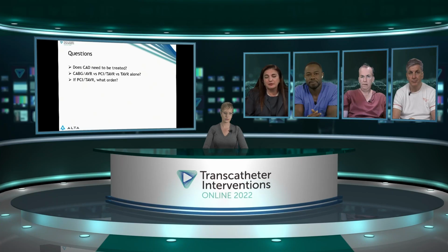You didn't notice, you didn't mention it, Sushil, but if there is MR and that circ is tight, I would really like to have seen that MR, the circumflex treated, because it could be an ischemic MR. Unless I saw it wrong, but I thought I saw some MR. Yeah, and we're going to go through a little bit more of the echo with Becky here in a second.